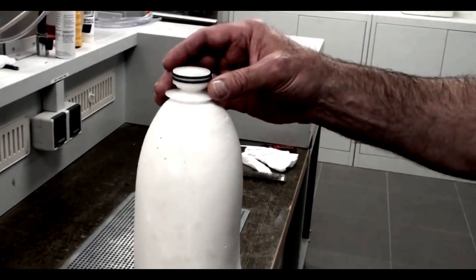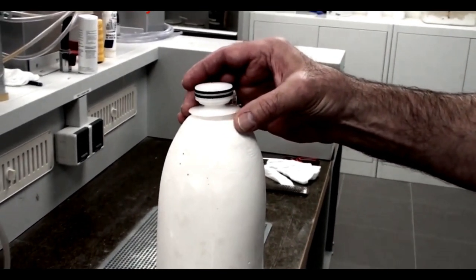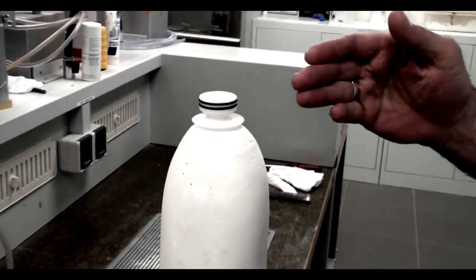It's important that you will flatten the bottom of the cast to receive the lamination dummy and prepare it in the proper position.